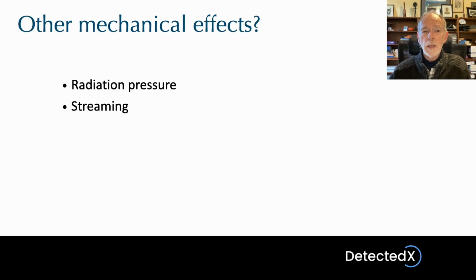Are there any other important biological effects that we would put under this heading of mechanical bioeffects? Well, there is one other really, and that's something referred to as radiation pressure or radiation force. When ultrasound strikes an object, such as some tissue, then if any of the energy is reflected or absorbed by that tissue, the ultrasound will exert a force on the tissue. So there is some force on every tissue that reflects or absorbs ultrasound. Normally, this is not considered to be potentially dangerous.